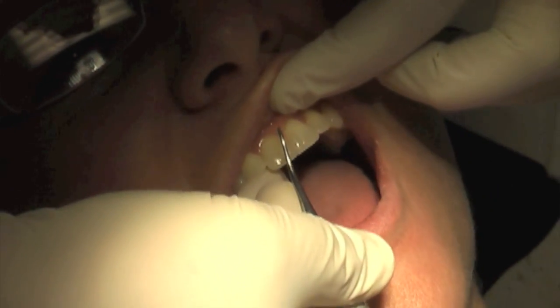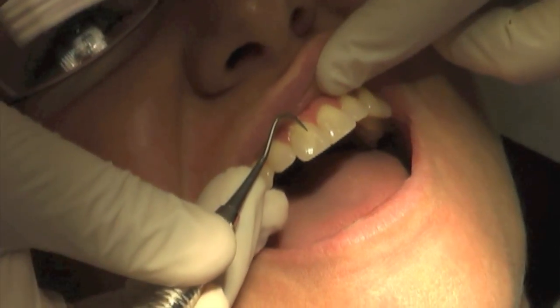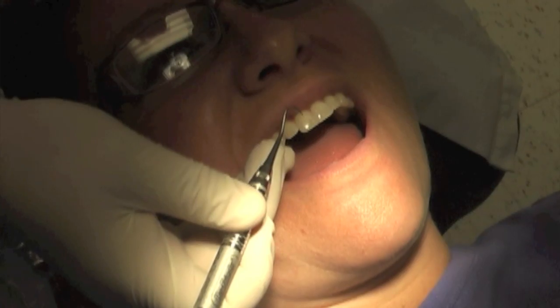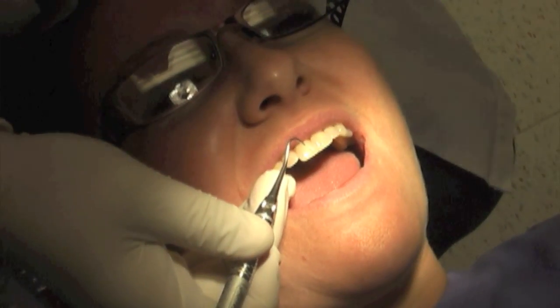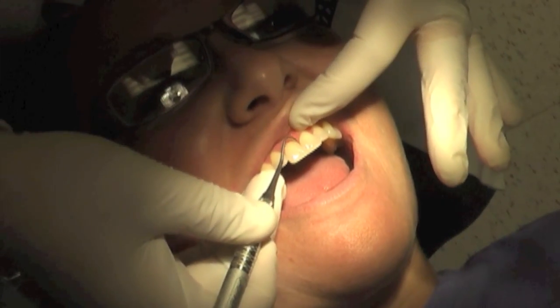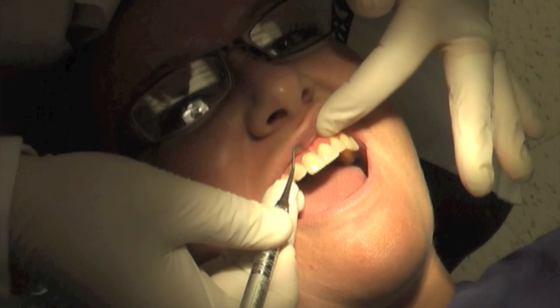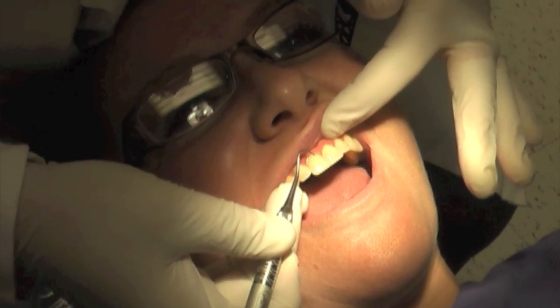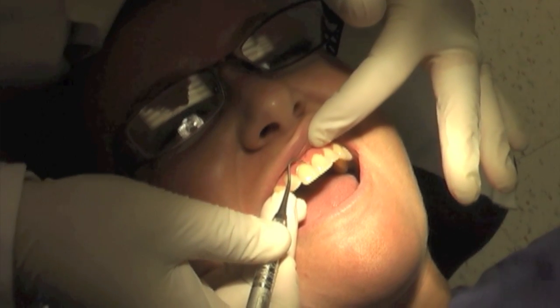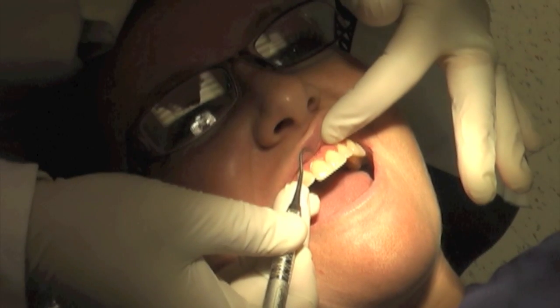We see a lot of incorrect adaptation when you go flat on your fulcrum. And I know it looks obvious when you're doing a video like this, but it really happens quite a bit where a student starts like this and comes around. What's wrong with that? I'm not perpendicular — why is that a problem? I'm going to cut, I'm going to poke them, which they're not going to be happy about, but I'm going to miss deposit.